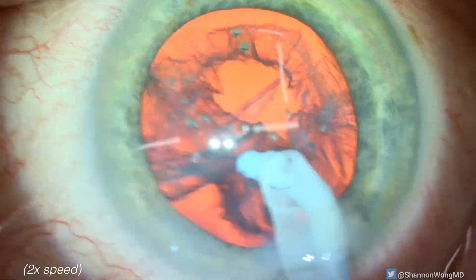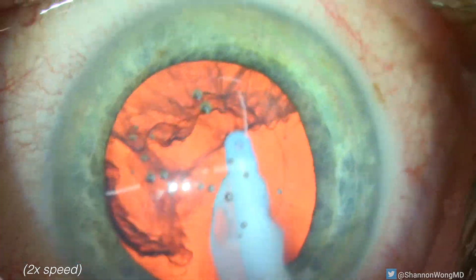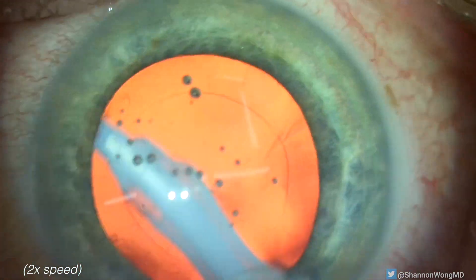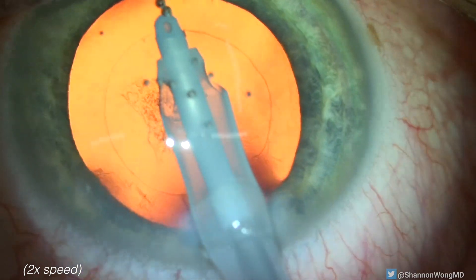Here we are doing routine basic cataract surgery. The case is going great. It's routine. We start to remove the lens cortex with our silicone tip irrigation and aspiration instrument made by Alcon. This tip is very capsule friendly, and we've used it on all of our cataract surgery cases for the past five years.